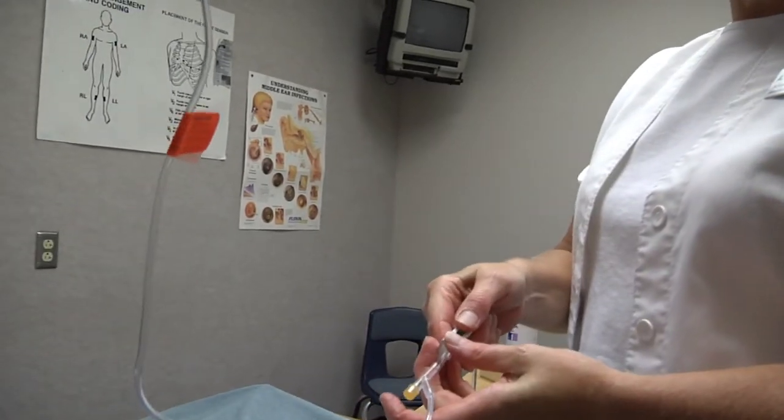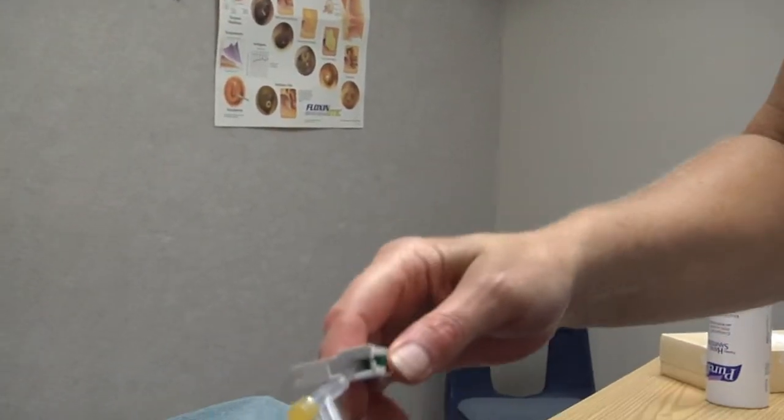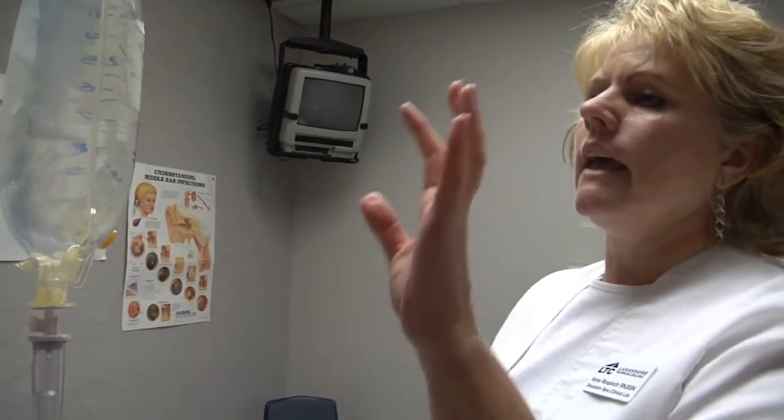What we're going to do is start at the top and work our way down. So I know that the IV solution that is running is D5 .45 normal saline, and that is what is ordered. If that was not the correct solution, then I would need to slow this IV down by roller clamping it down, going out and getting the correct solution, coming back and hanging that ordered solution. In that case, I would have to fill out an incident report depending on what your agency would require of you. But in our case, the solution is running correctly, and so I don't have to worry about changing that solution out.